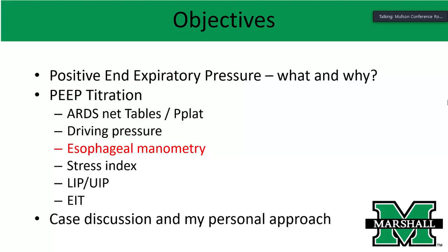So I would not wait 12, 18 hours to make a decision about small changes in PEEP. But you're right, you can increase the PEEP, and what I would say is I would come back maybe 2 or 3 hours later to evaluate how the patient is doing. If he is less hypoxic, not hypotensive, and like I said, his plateau increased only by 1 or did not increase at all, then I think you're recruiting, and I would just keep going until he hits that threshold. Some people talk about doing recruitment maneuvers very slowly, some very quickly. I think as long as you evaluate.